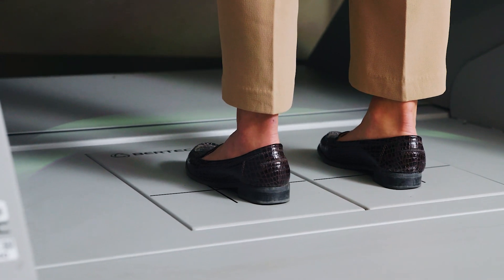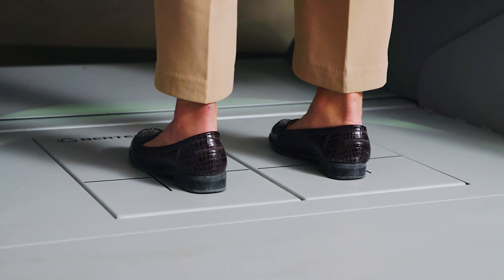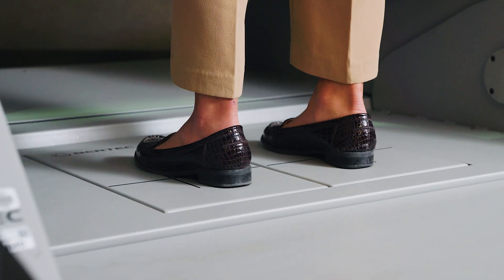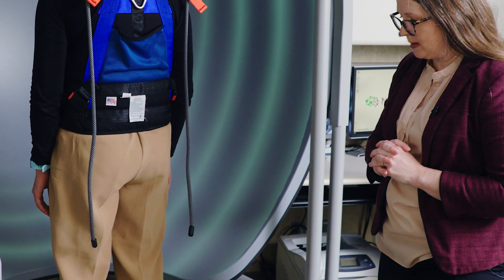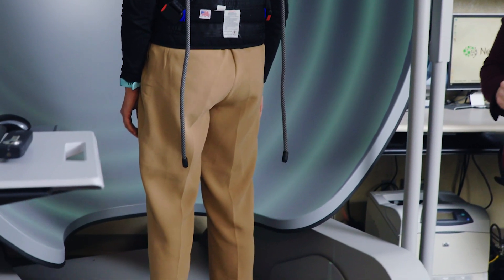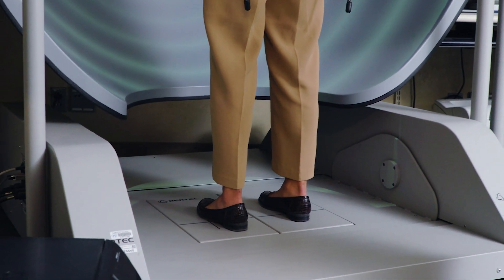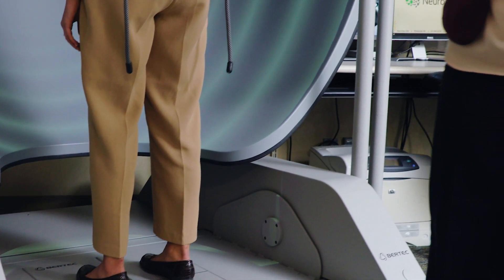From there, we want to make this a little more challenging by introducing some variations in the floor. Many times patients have difficulty maintaining their balance when there's an unstable surface. The force plate is actually unstable and can tip back and forth in response to Sarah's balance. So she has complete control over trying to maintain balance and keeping the floor stable. This can be very difficult for patients, particularly those who have challenges with peripheral neuropathy, diabetes, or any other sensory disorders that affect the lower limbs.